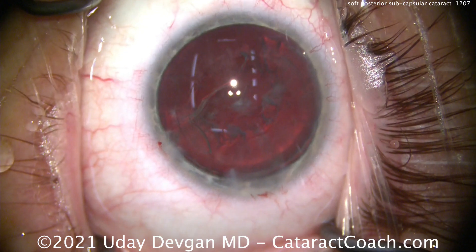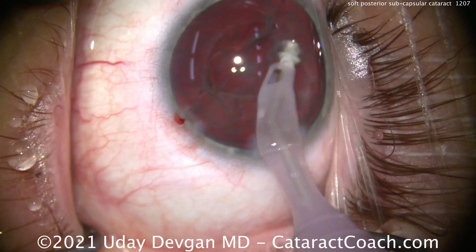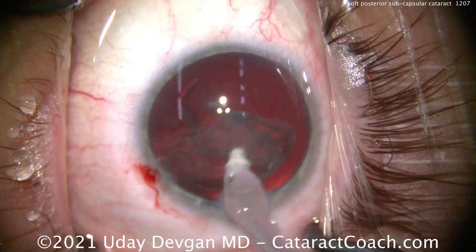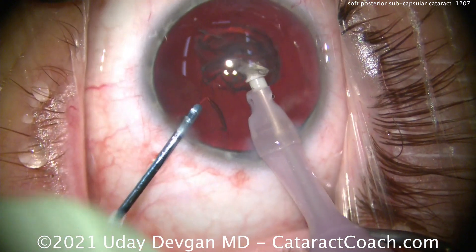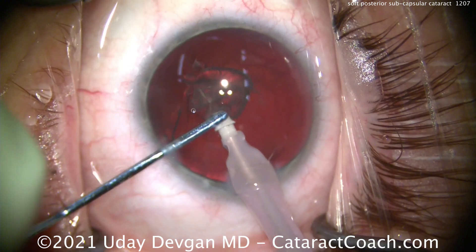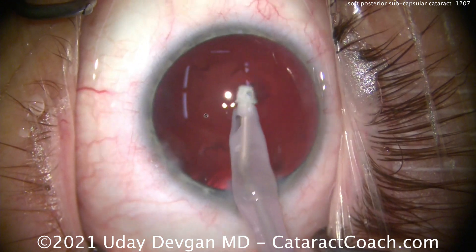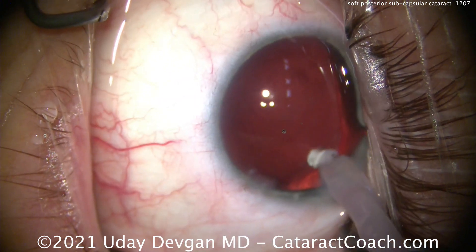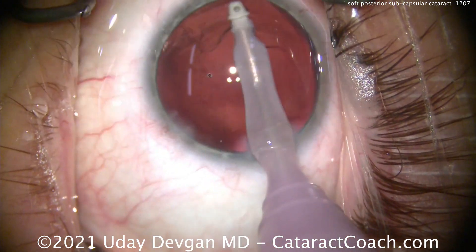The I/A probe will be doing most of the work here, removing residual cortex and polishing up the capsule. The I/A probe has a soft polymer tip, giving a much higher margin of safety compared to the steel tip of the phaco probe. Teasing up a big piece of cortex and aspirating it easily. We need to do a lot of polishing of the posterior capsule — it's a delicate balance, as the posterior capsule is only four microns thick, about half a red blood cell or a twentieth the thickness of a hair.